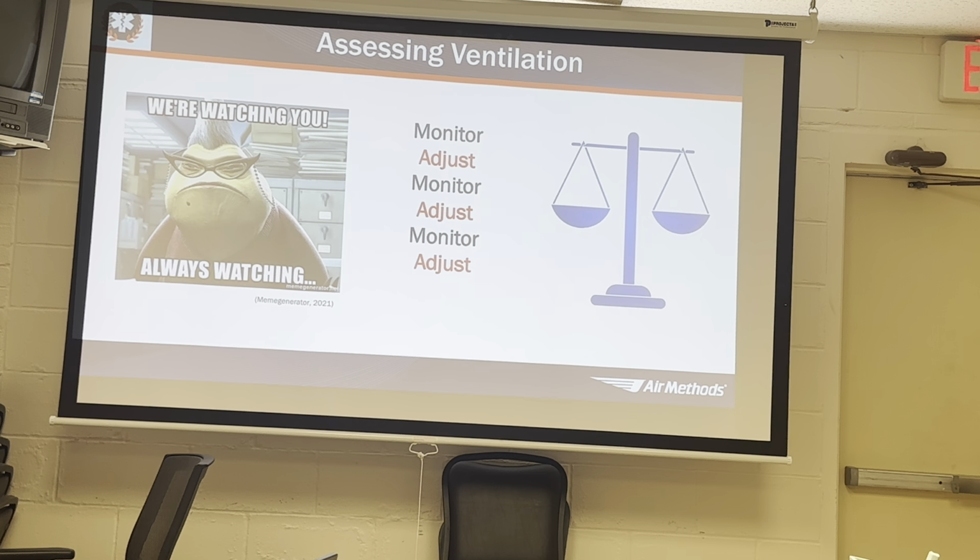Even if you take 2 minutes, and you can download an app if you would like, just make sure: is she getting the right amount, or are we giving her the amount that the 6 foot guy who came in needs? It's really going to cause lung injury if we're over-ventilating our patients with volume or pressures.